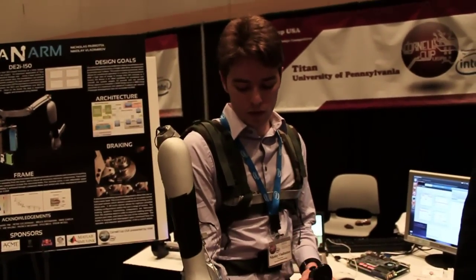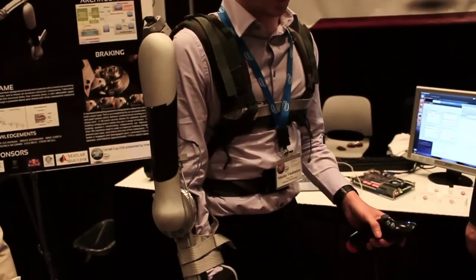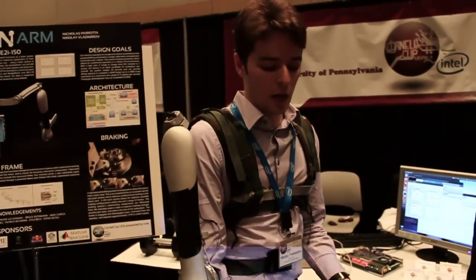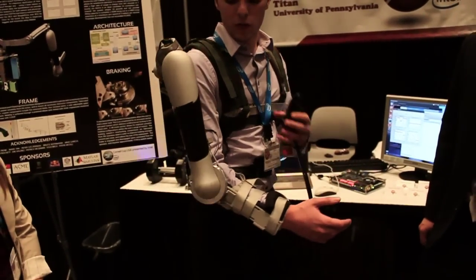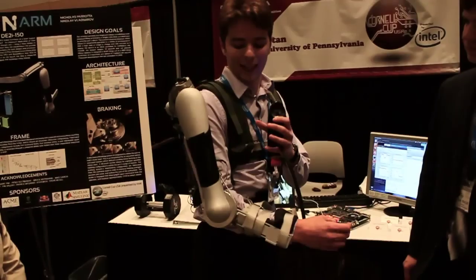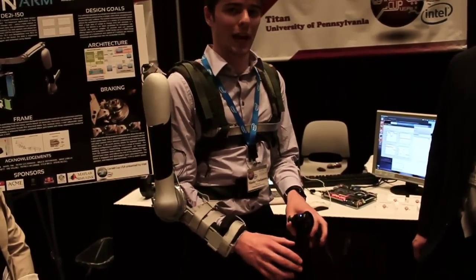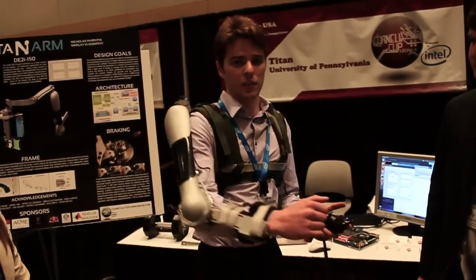Another application of this device is physical therapy and regaining lost mobility. Somebody who has gone through an elbow injury, which is quite common in sports and athletics, can use this to regain that lost mobility during physical therapy. We also have a very intricate shoulder linkage that can keep track of a person's shoulder mobility, so a doctor can log in remotely and check their progress every day.